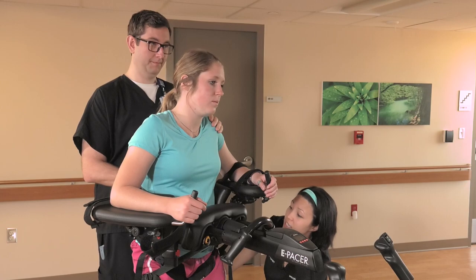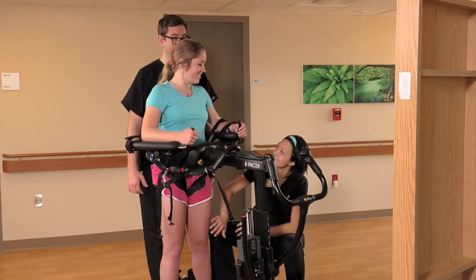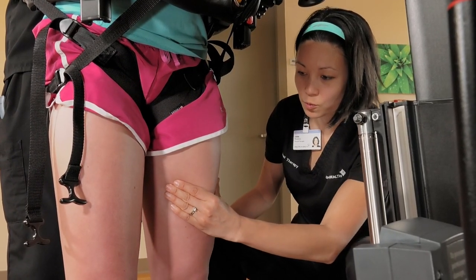After a minute, give the patient a chance to rest. Stand for another minute when the patient has strength to extend. Tap or squeeze the quads as necessary to encourage extension.